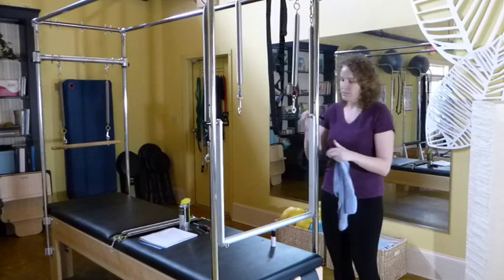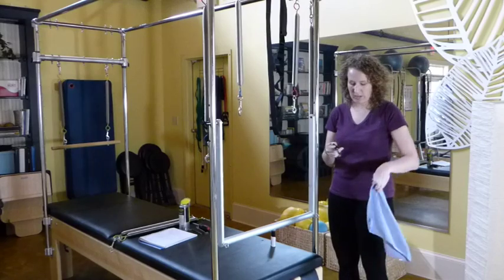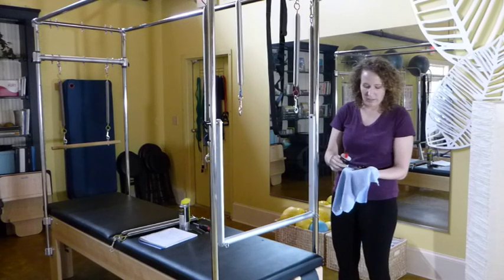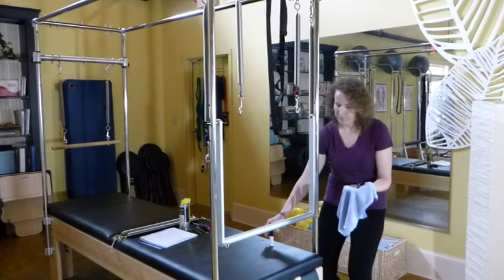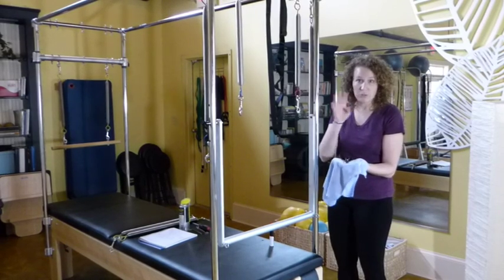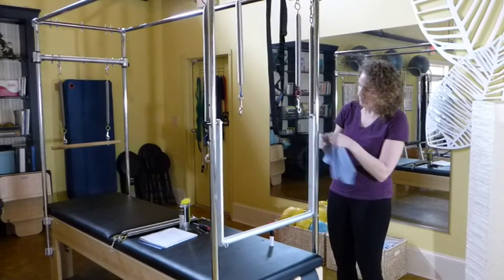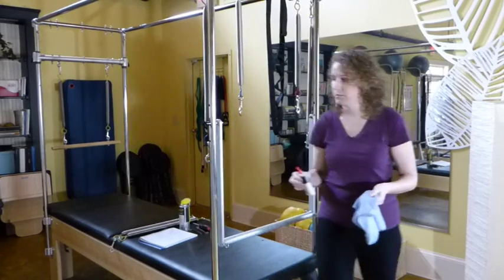Okay? Take one T-pin out. I'm just going to let the push-through bar sit here, nice and quiet. Okay? Wipe the surface of the T-pin with your dry rag. And then let's put a little bit of oil along the length of the T-pin. Make sure you get the excess off because we don't need it to be dripping everywhere. And then let's reinsert the T-pin. Good. Make sure you wipe out any drips that you see. Let's repeat on the other side.